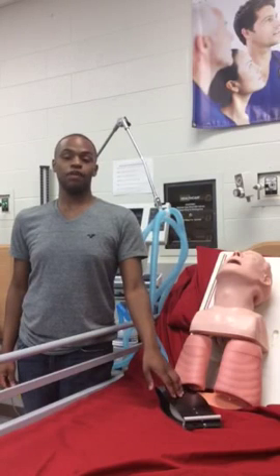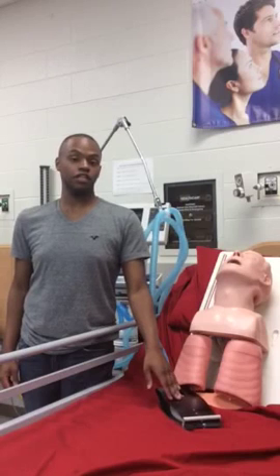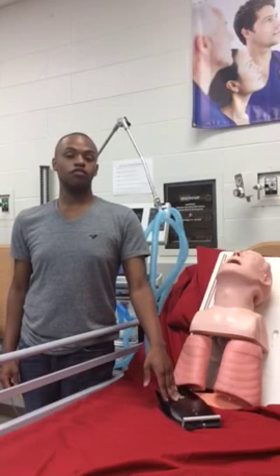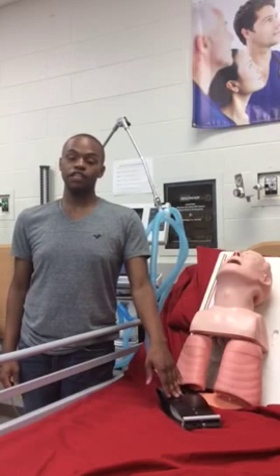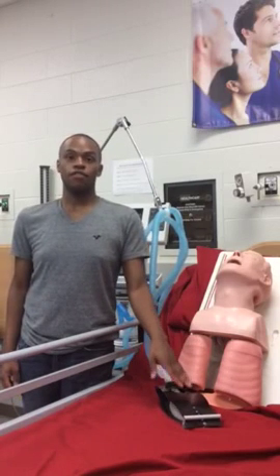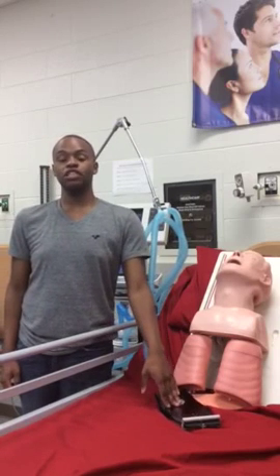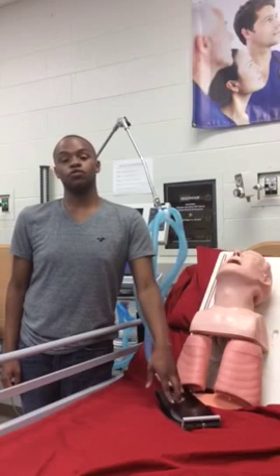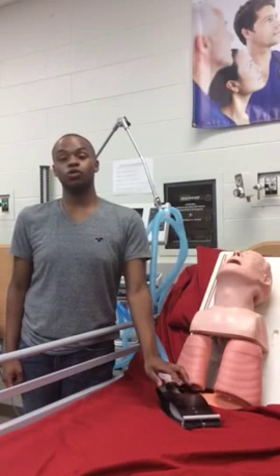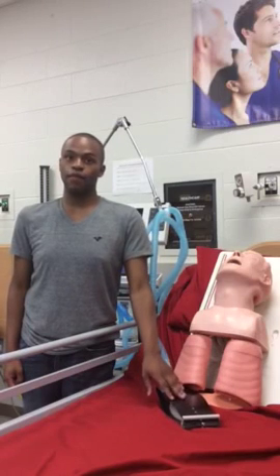First, I can look at her spontaneous tidal volume, which happens to be 250 milliliters. Now the range is 4 to 6 milliliters per kilogram. She happens to be 50 kilograms, so if you take the 4, that's 200. If you take the 6, that's 300. So she's smack down in the middle at 250. Next, I look at her respiratory rate. Her spontaneous respiratory rate is 14, which is less than 30, so we're happy with that.